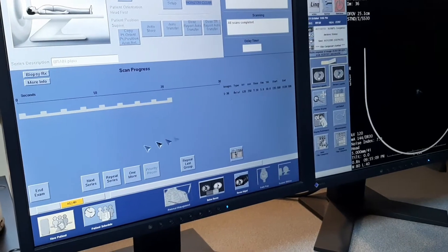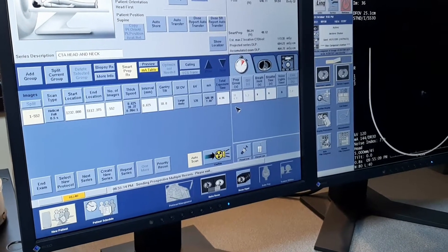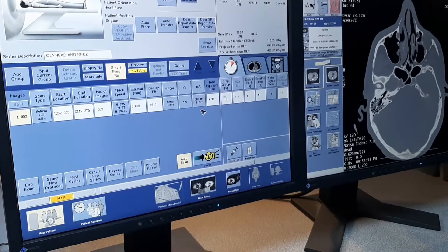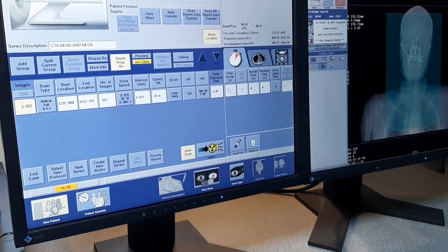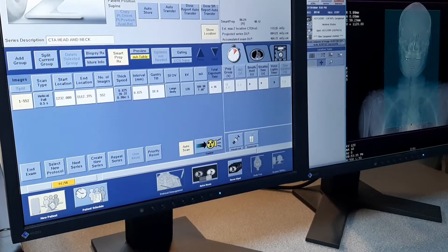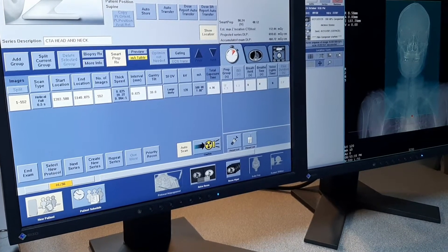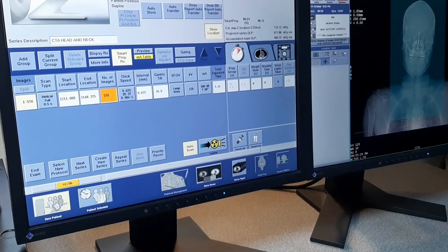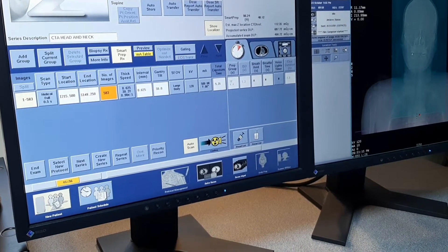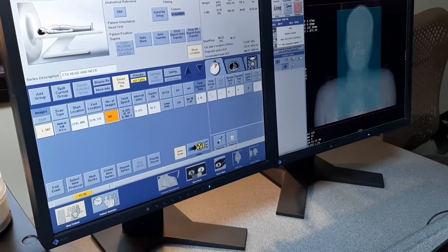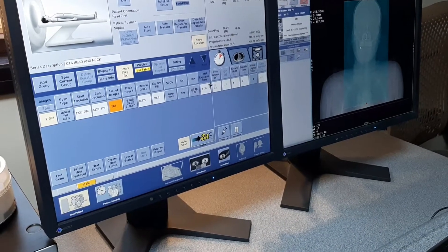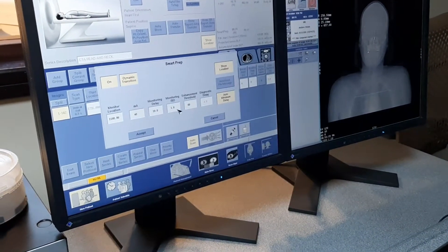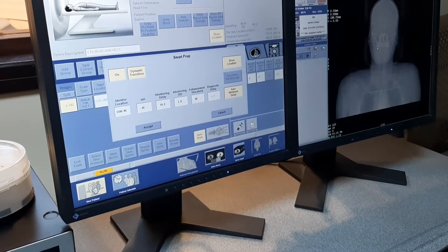Station is moving. Check — yes, the scanning should be going down to up. Check this one. Plan is finished. Go to the smart protocol — Smart Prep. Yes. Now check for the ascending aortic arch. Put in the aortic arch.